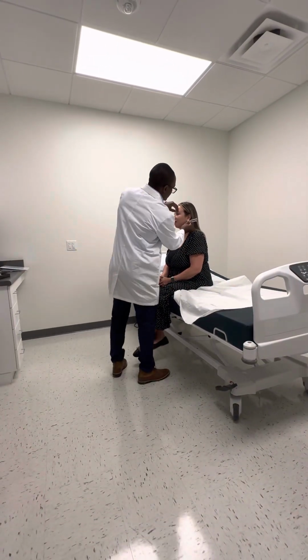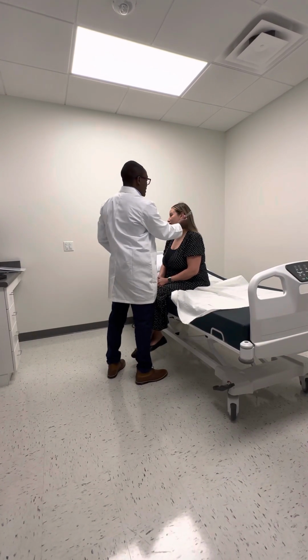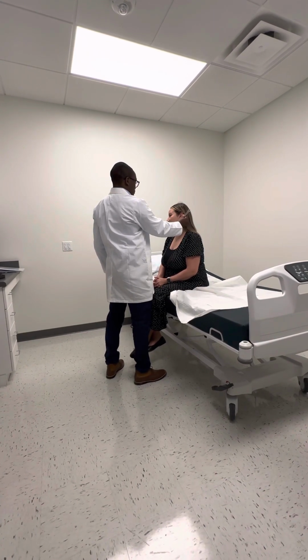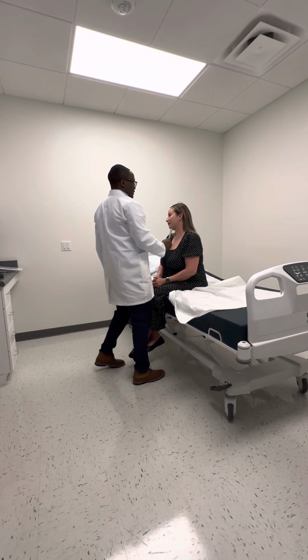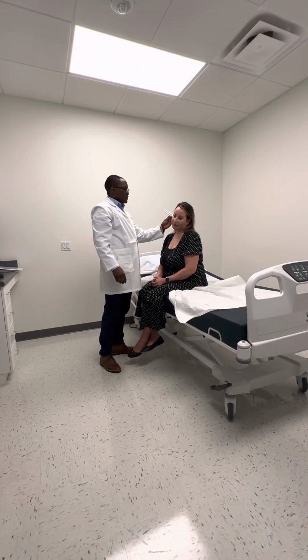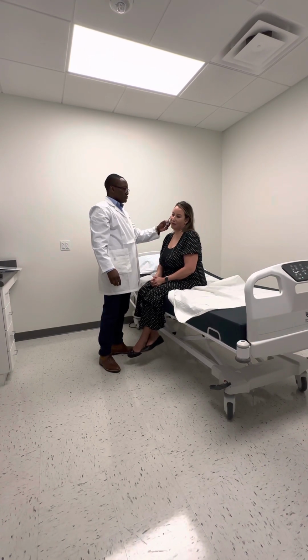So, I'm going to place it on the mastoid. I'm testing for bone conduction. Tell me when it stops, okay? Stop. Are you able to hear it? Yes. Okay. Tell me when it stops. There. Are you able to hear it? No. Do it again.